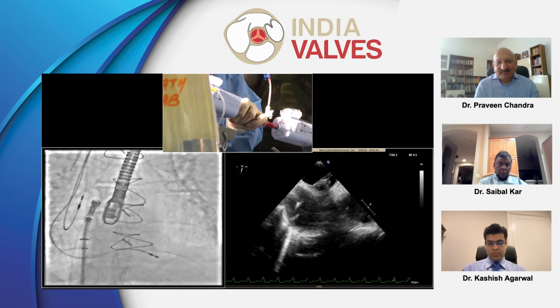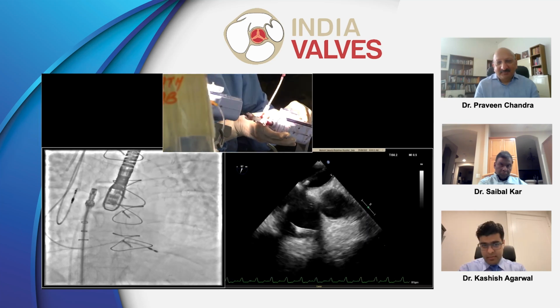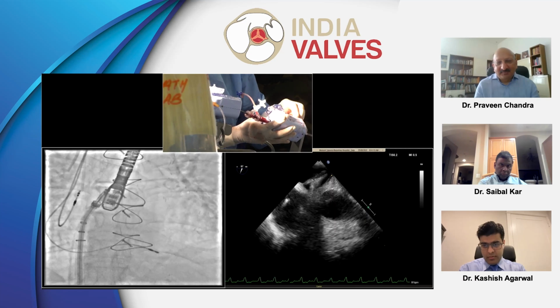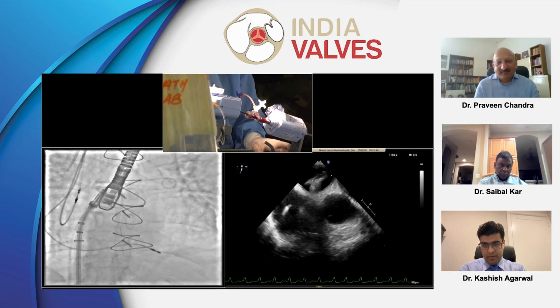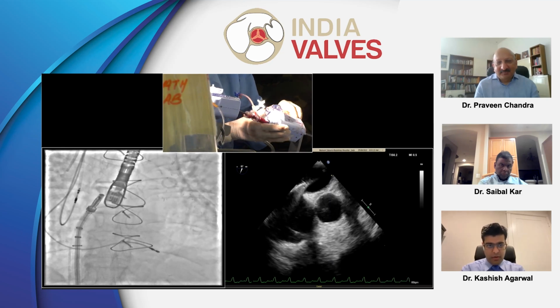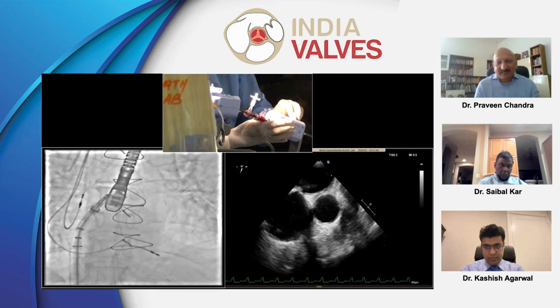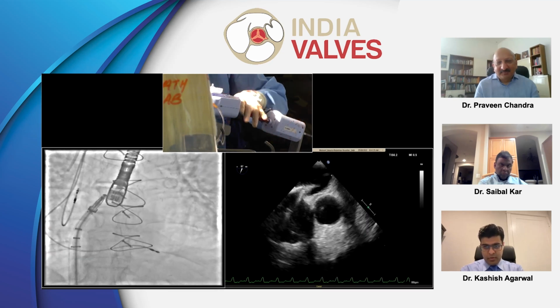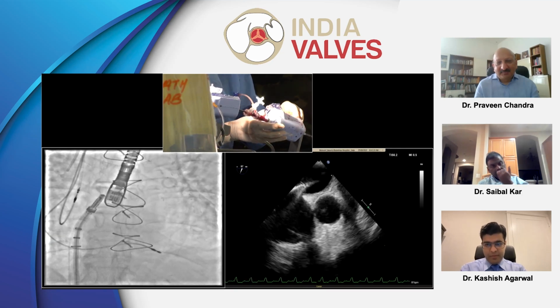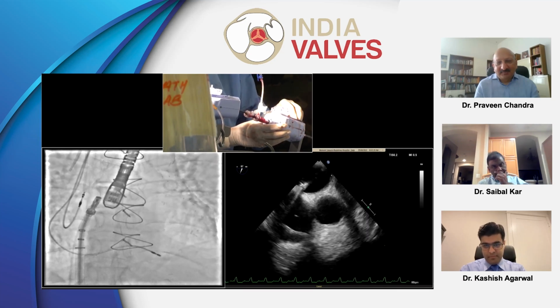Okay, short axis, Prashant. Okay. So I'm going to pull back a little. Pull the guide back and go anterior or posterior, and kind of go into the P vein, anterior almost. Okay, let's see the tip, Prashant. So I'm going to try to straddle. So go posterior, actually follow the pigtail because that's going into the P vein. Then you'll have room to go in. Okay, Prashant, show us the tip.